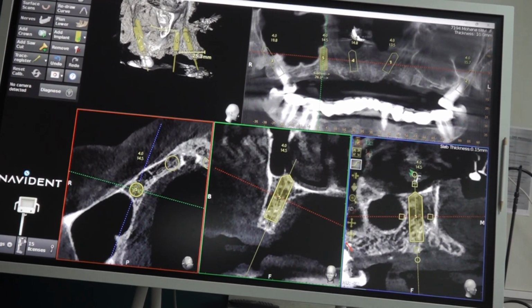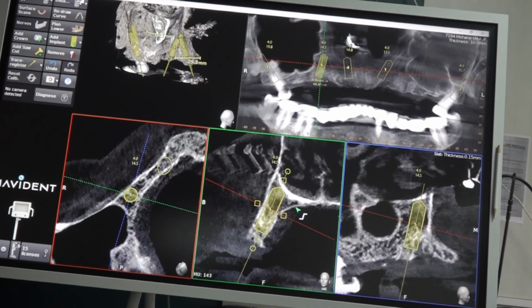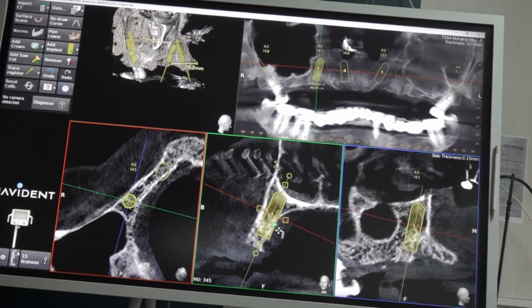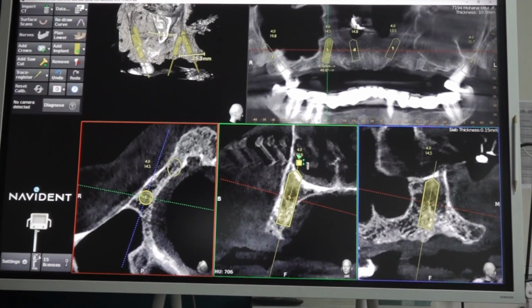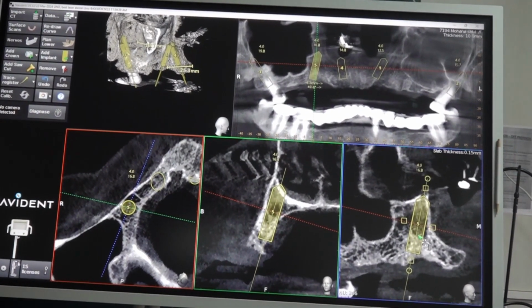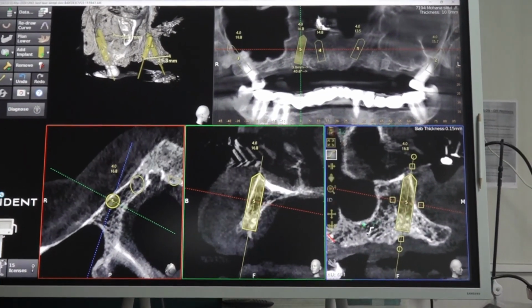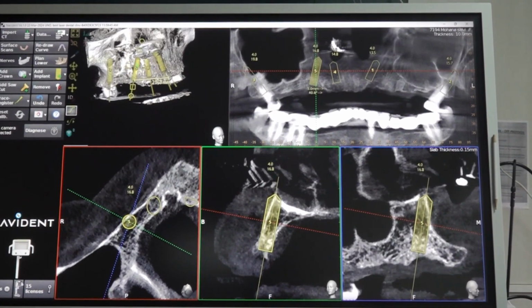We'll just try tilting it anterior. If you tilt anteriorly, we can go for the palatal to buccal approach. I'm just shifting it more anteriorly so that we are entering the buttress area.